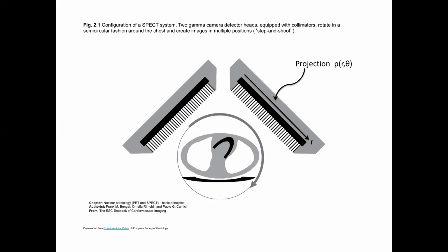This is one example, right? Technetium is a substance that is, I don't know, maybe 75% of nuclear medicine or more is done with technetium because it has the properties that a 6-hour half-life means it's easy to work with. You don't have to run down the hall with your agent because it has a 12-minute half-life and inject it into the patient and image them right away. The 6-hour half-life is kind of leisurely. You can leave it on the shelf for an hour, inject it into the patient. I mean, it's decaying away, but there's still a lot of radiation there.